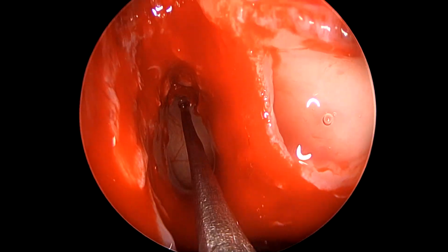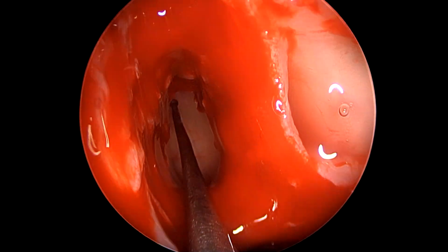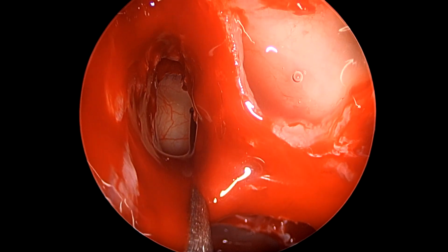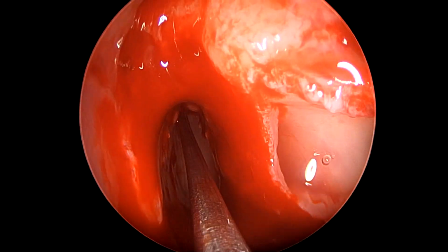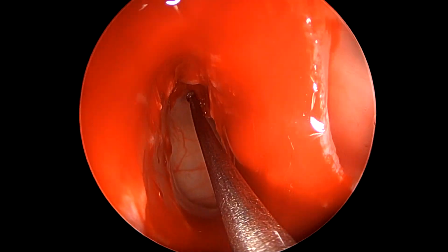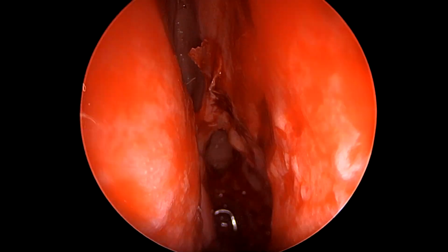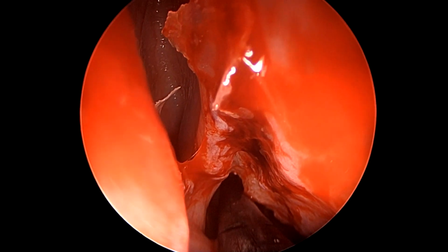As you can see, we are able to push it backwards, but still some part of it remains, which obstructs our view. But for the most part, the opening has been made really wide and patent in our access, and the frontal sinus proper, which was earlier restricted, has also been opened. This is the instrument which is going inside it. As you see here, now with an angled endoscope we are working.